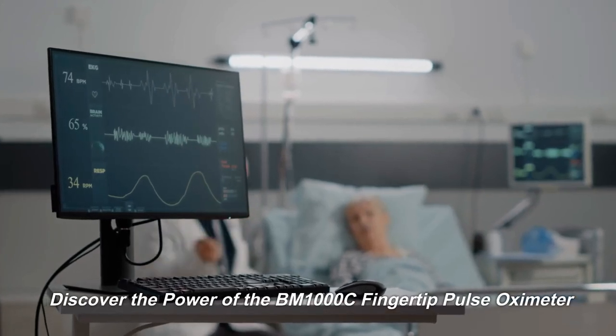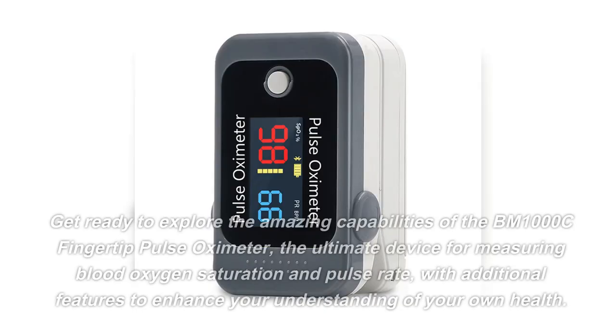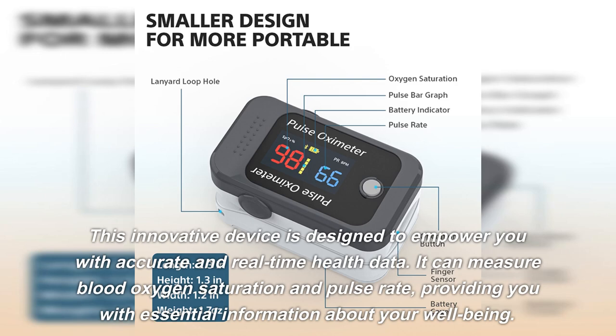Discover the power of the BM1000C fingertip pulse oximeter — the ultimate device for measuring blood oxygen saturation and pulse rate, with additional features to enhance your understanding of your own health. This innovative device is designed to empower you with accurate and real-time health data.